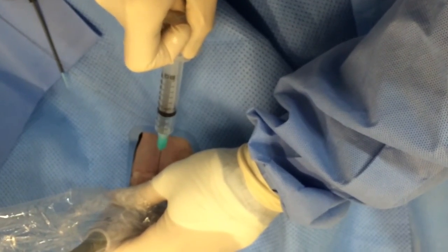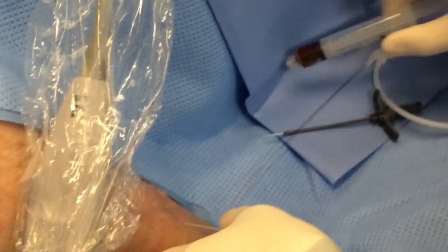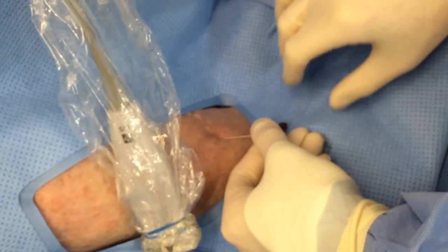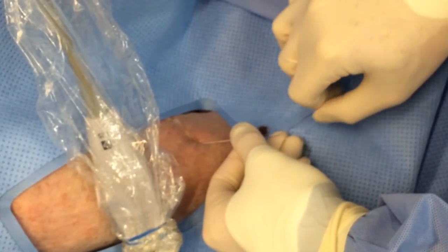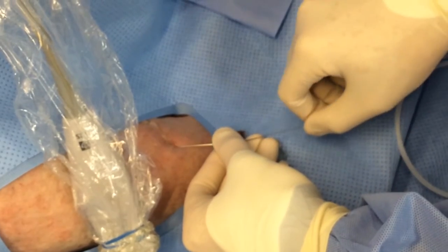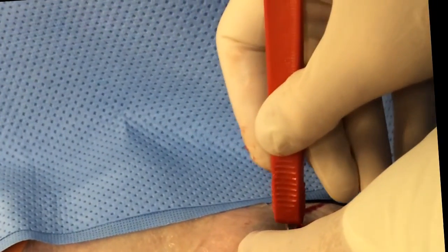All right, he's now poking with the non-safety needle. He gets his flash, disconnects the syringe, takes the beautiful floppy wire, advancing it into the vein. And you can see it goes super easy, telling you have a nice patent vein. We feel good about this. You don't have to put it all in. You really just need enough so that you're about halfway down the wire.